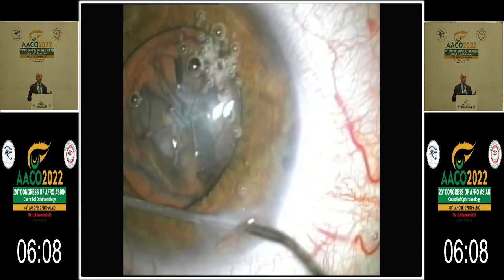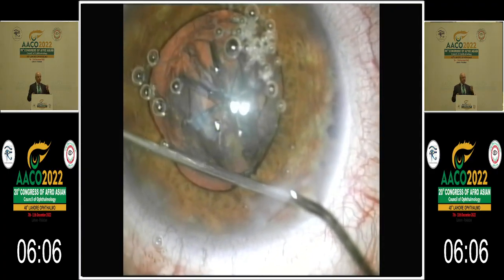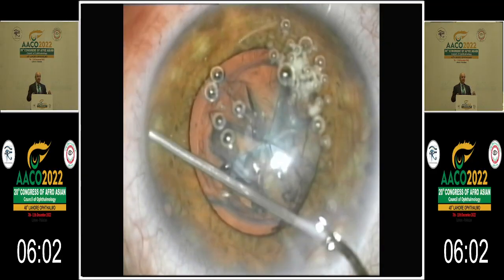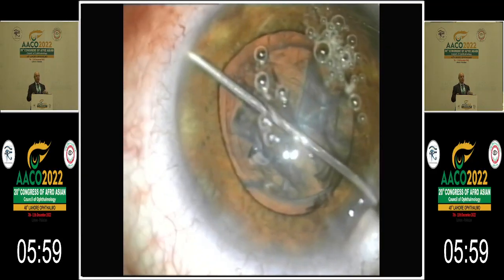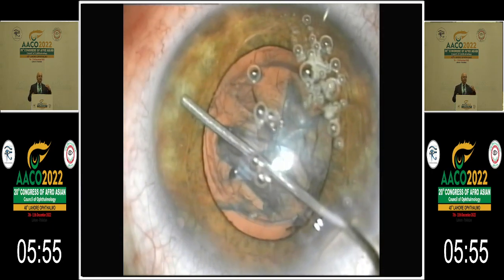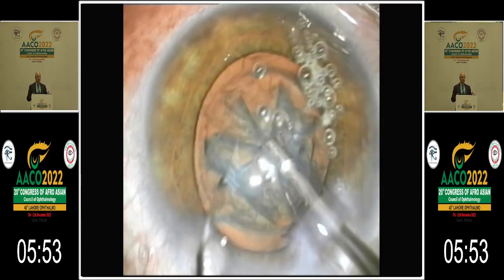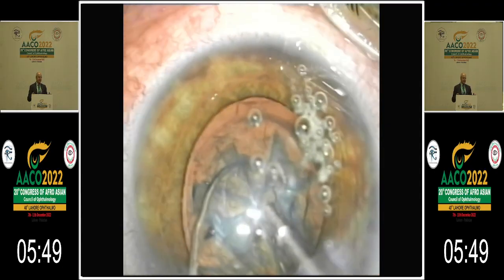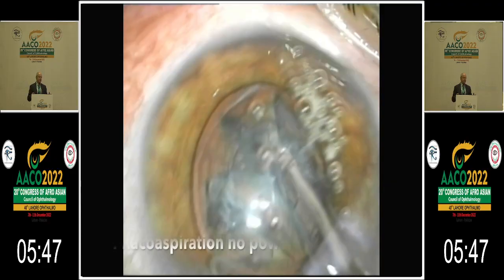And in any glaucoma patient, you really need to protect the corneal endothelium. You protect it with viscoelastic, you protect it with the proper technique working essentially in the capsular bag, as well as using the least power that is needed to remove the cataract. You see it's already pre-sliced. It's not a hard cataract.